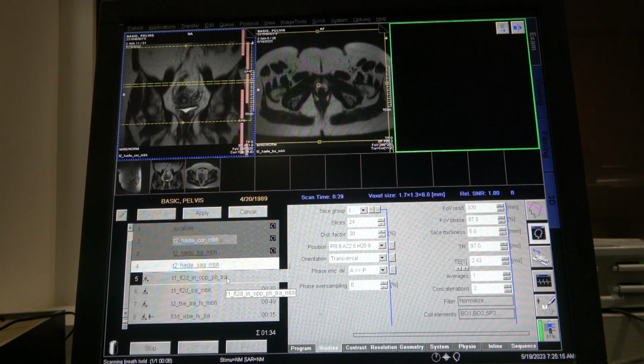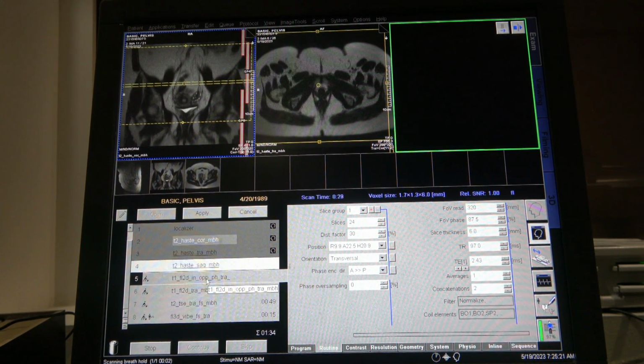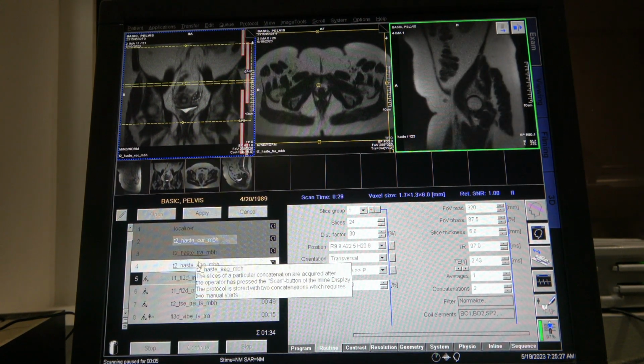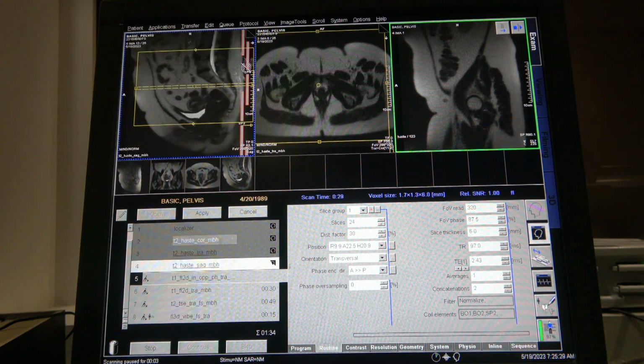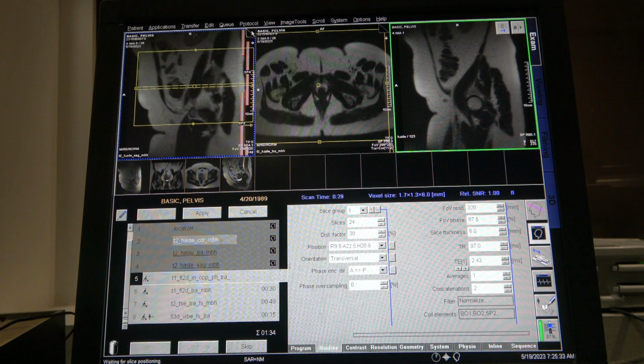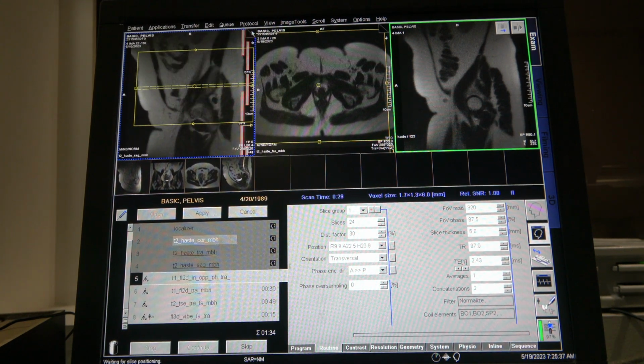All right. TRA and Siemens is axials, okay? So all we have to do, breathe. All we have to do is copy and paste, all right? So let's look at our sagittal. Not bad. A little grainy, but not bad.